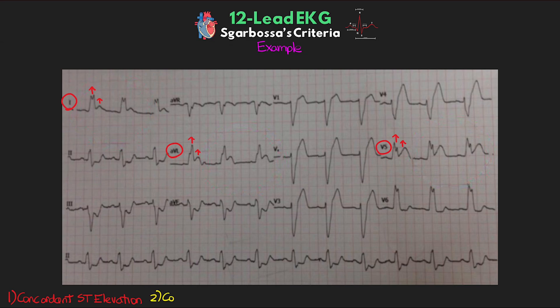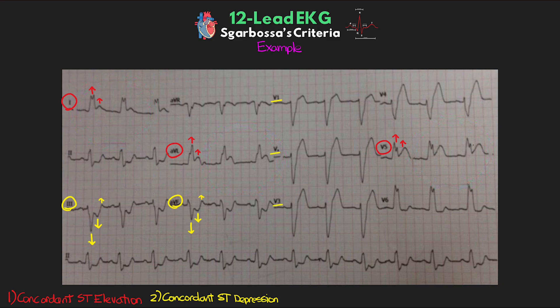Next, let's look for concordant ST depression. Hopefully you're able to spot the two easy ones in our inferior leads — lead III and AVF. We have predominantly negative S-waves, so we'd expect to see positive T-waves, which we do have here, as well as normally we'd expect ST elevation. But instead here we have ST depression — that is concordant ST depression. In this example, the concordant ST depression is not present in V1 through V3, so this example wouldn't independently indicate STEMI. What we're probably seeing is more in the context of reciprocal changes in the inferior leads due to a high lateral STEMI. But it serves as a good example of what concordant ST depression looks like.